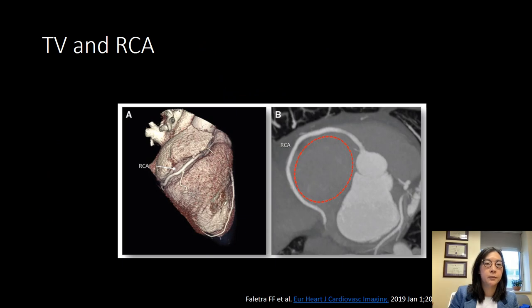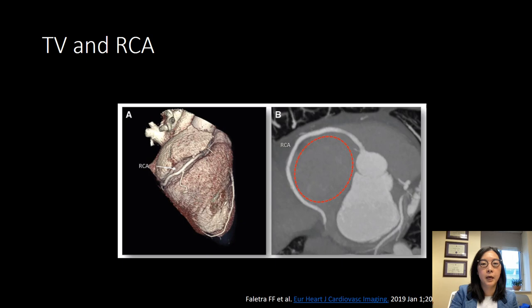When we look at the coronary circulation, the right coronary artery actually surrounds three-quarters of the tricuspid valve annulus. A CT scan shows the tricuspid valve annulus with the right coronary artery and its path, and you can see that it's closer to the tricuspid valve annulus towards the distal part of the coronary as opposed to the origin.